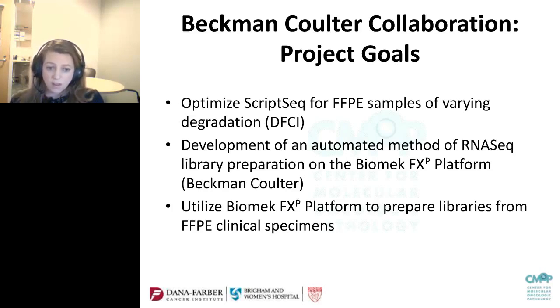The big thing about paraffin-embedded tissues is that this is the routine preservation method that is used throughout hospitals, throughout research. Archive collections are stored for decades, and they're an invaluable tool for biomedical research. Large cohorts of samples are required for any sort of meaningful clinical discovery, but extensive RNA fragmentation and cross-linking have been a limiting factor for clinical translation applications, which would lead to biomarker discovery.